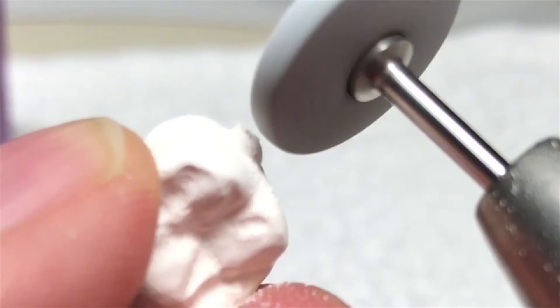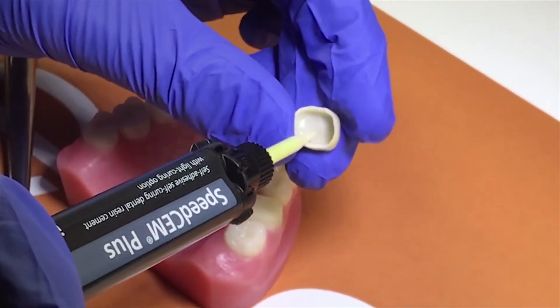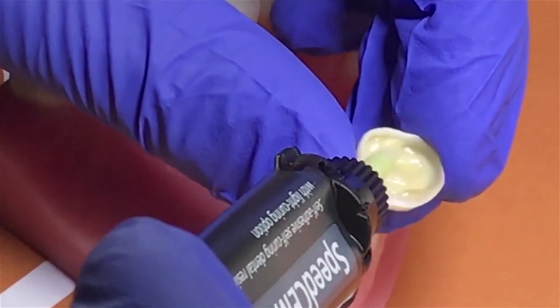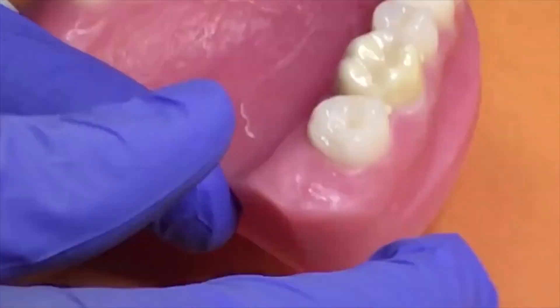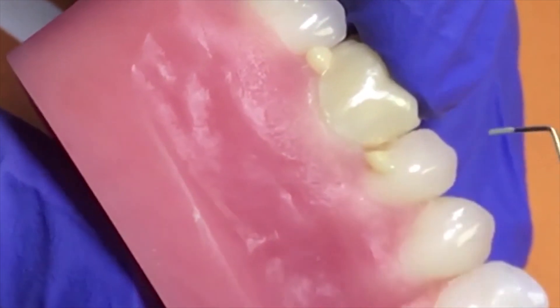The process to cement a zirconia crown is similar. The zirconia restoration is milled and sintered. The restoration is polished and tried in for fit. The SpeedCem Plus cement is placed inside of the restoration and the restoration seated on the tooth. After the initial gel phase, the cement is easily cleaned with an explorer. The ease of cleanup with SpeedCem Plus makes it an ideal cement in the appropriate clinical situations. Even though we're viewing this on a typodont, this allows us to see how easy the cement is to clean up.